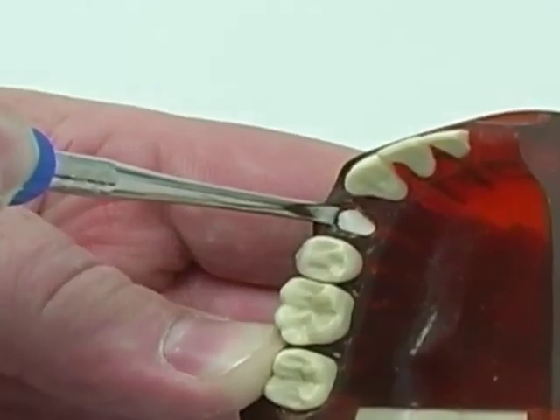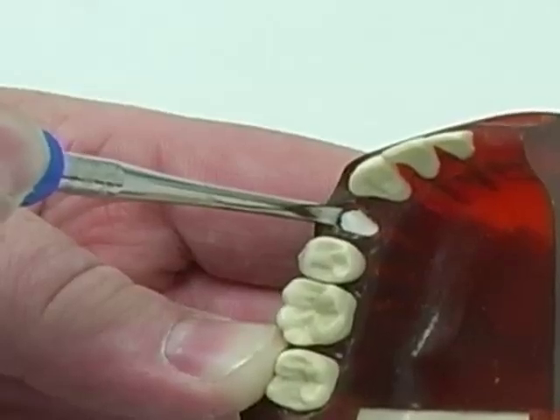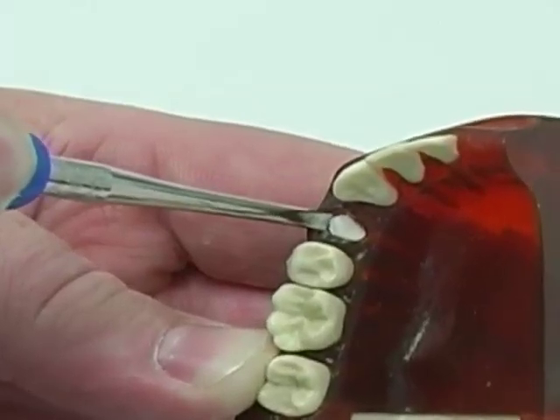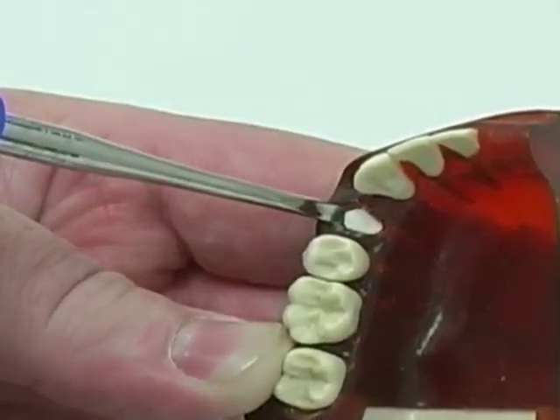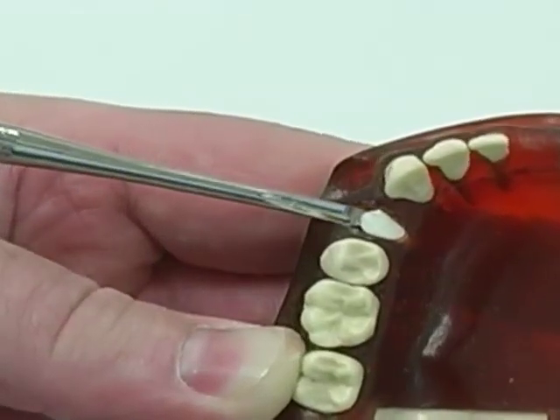It can be done as here on the buccal; it can also be done mesial, distal, or even lingual. Be careful that the instrument does not slip into the floor of the mouth. You squeeze it in between the bone and the root, the instrument goes down, and at some point you can use it as a lever and rotate the instrument, thereby extracting the root.